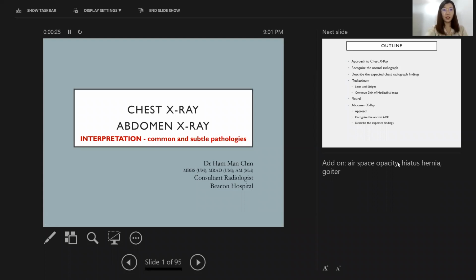Hi, good evening, everyone. So I'm Man Chin from Beacon Hospital. I would like to share with you a presentation about chest X-ray and abdominal X-ray. We will target the interpretation to identify the normal, then only we identify the common and subtle pathologies on chest X-ray and abdomen X-ray. First of all, I would like to thank Dr. Betty for inviting me to become a speaker today. In between, if you have any question, you can stop me or put in a question in the chat box. I will try to explain and answer your questions.